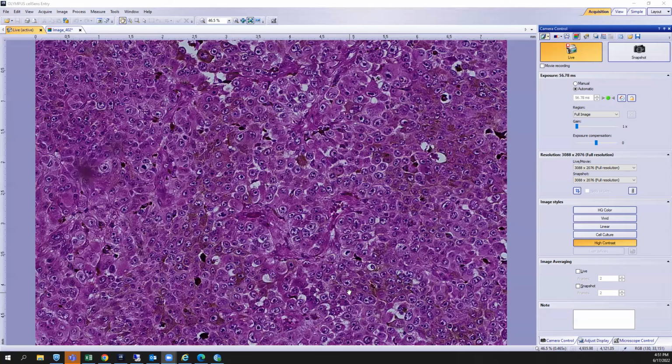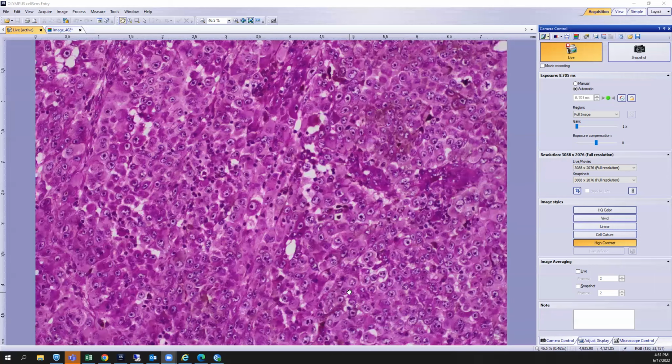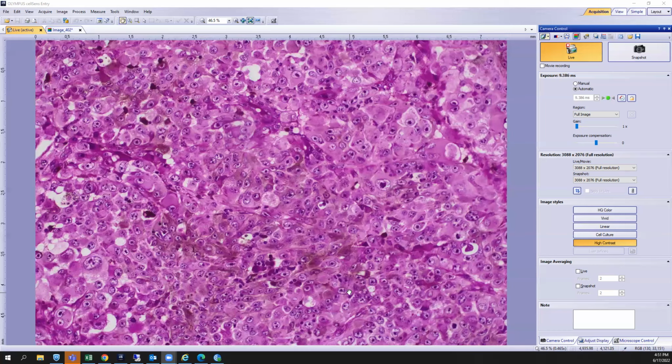So overall, this is consistent with a nodular melanoma. It does have a predominantly vertical growth phase, and it's measured to be at 6 millimeters Breslow depth, and that's based on just the base of the ulcer.